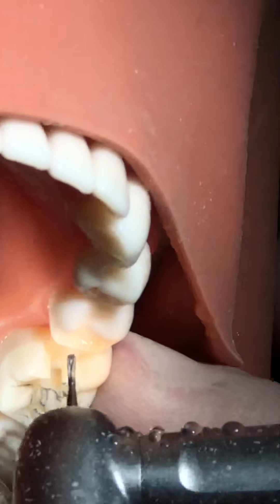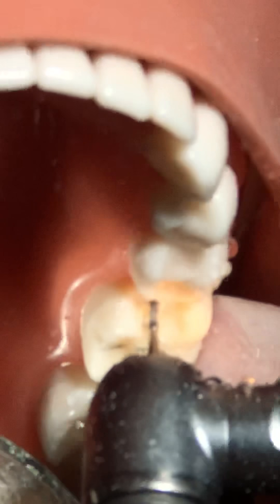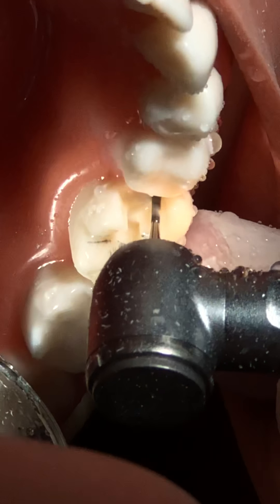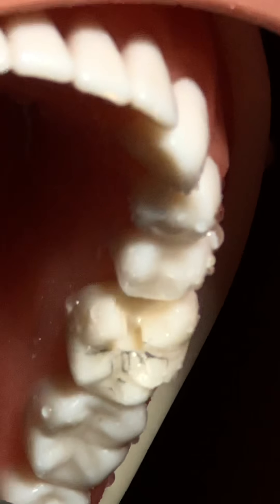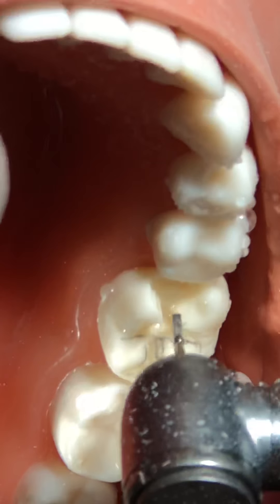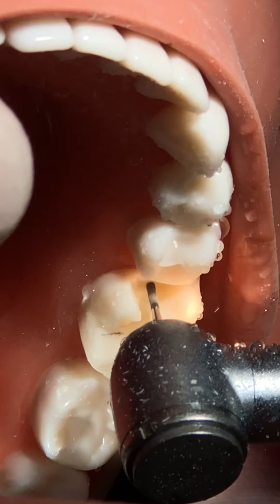We will extend deeper in the isthmus area, going to 1 to 1.5 bur widths deep. The isthmus or axial wall should be in the form of an arc, because the outer surface of the tooth is curved. The handpiece should move along that arc and be slightly tilted towards the distal portion - the axial wall should not be straight, it should be arc-shaped and slightly de-angulated.